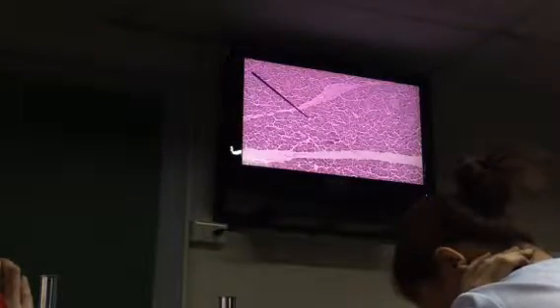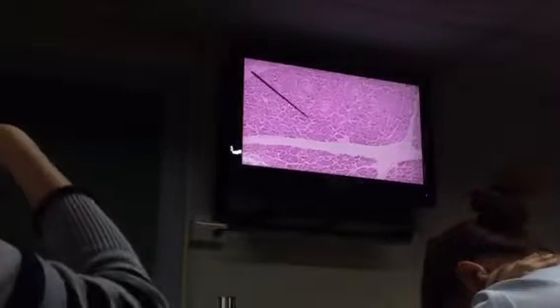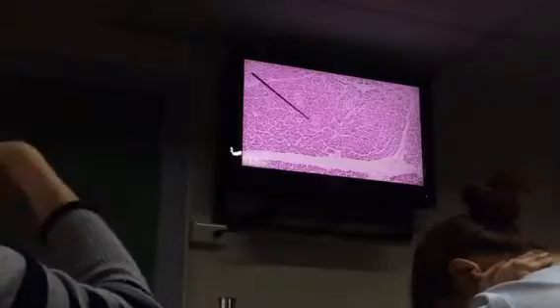Most of these are acinar cells. I think you remember, acinar cells are described as pyramidal, arranged in circles or round clusters, correct? Now, on the other hand, you find in between acinar cells your islets of Langerhans. So let's look at this under low power.